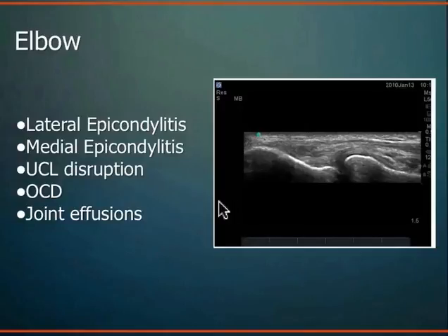So around the elbow, a couple very common diagnoses, whether it's tennis elbow or golfer's elbow, lateral epicondylitis or medial epicondylitis. There's multiple names for it, but you can image those areas quite well. So this is the distal humerus, humeral radial joint or capitellar radial joint, radial head. And this is the extensor tendon coming in and attaching on the humerus lateral epicondyle here. So superficial, deep bone structure, tendon tissue coming across the joint space and attaching onto the lateral epicondyle.